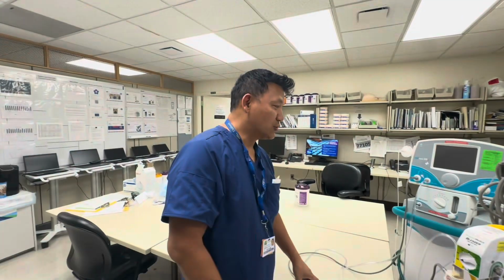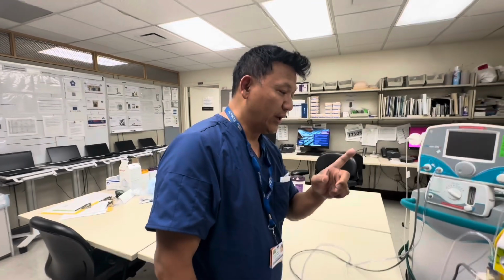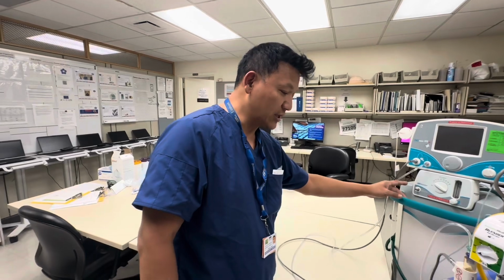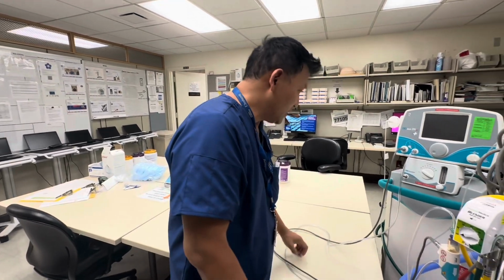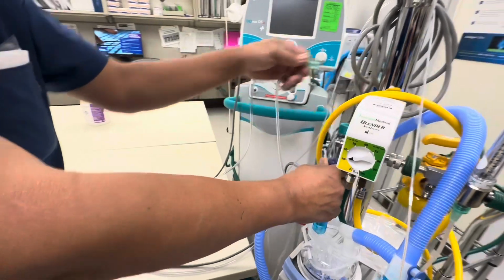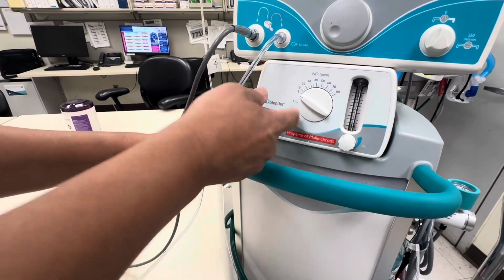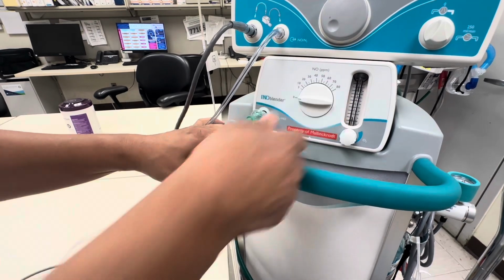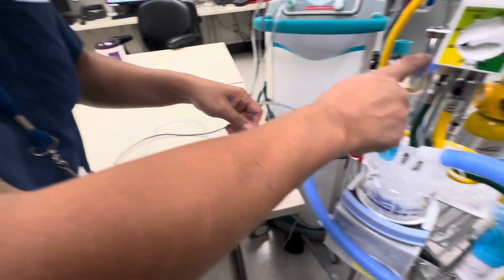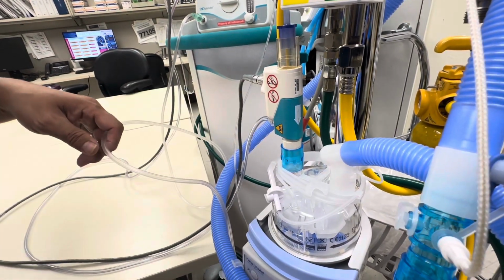I'm gonna join. So I just wanna add to the video that what we did was, before the blender earlier, we tried to go directly from the O2, this O2 right here, directly to here, to the module. We thought this was a blender, it was blending the O2, and then the module was connected to the airvo.